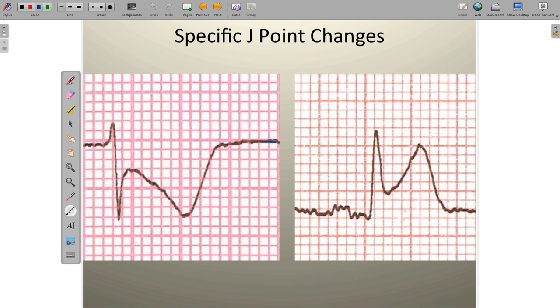Let me place the isoelectric line here, where that blue line is, and I'm also going to place a line at the level of the J point. Next, we want to determine where the J point is in relation to the isoelectric line. In this case it's pretty easy to see that the J point is well below isoelectric — about 3 to 3.5 millimeters below. One of the things that can happen is the J point can drop below isoelectric. We tend to refer to this as ST segment depression, but the better way to describe it is J point depression.